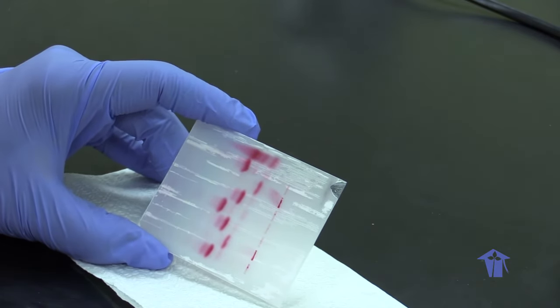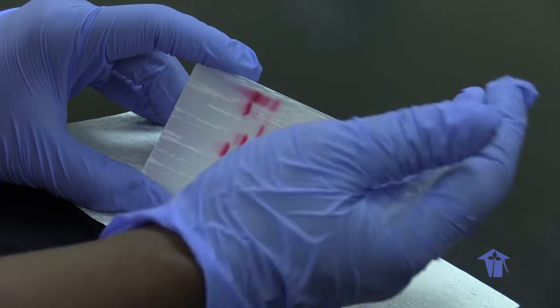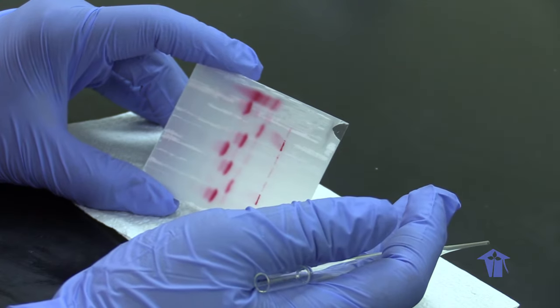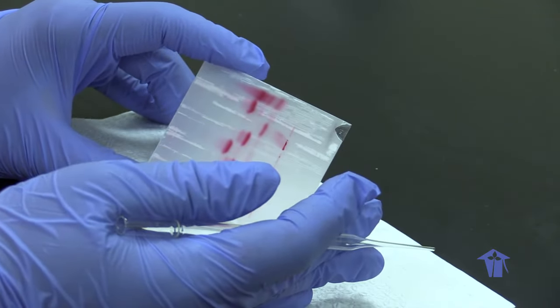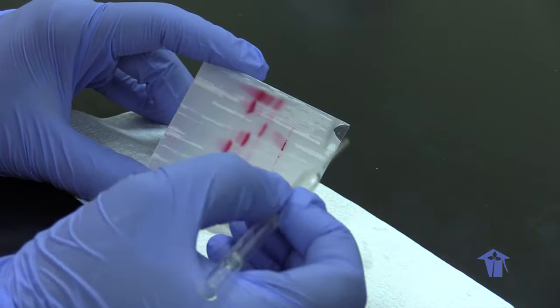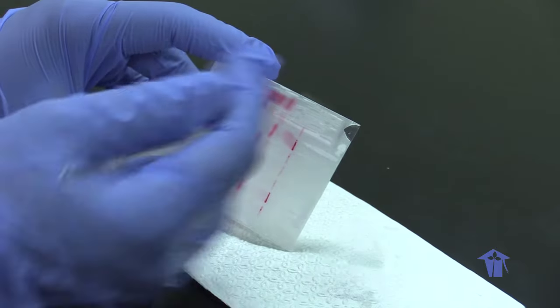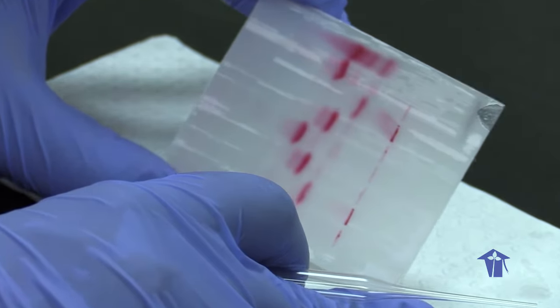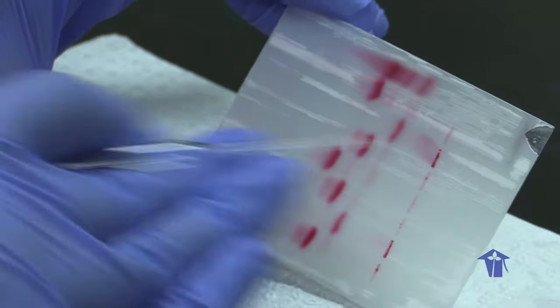Okay, so this is how the HBEP turned out. The white background that you're seeing is because of the Permaclear, so that is a limitation of the lab. Your Permaclear needs to be freshly made up, and therefore the entire plate or the acetate will be cleared up, and when it dried, the plate itself will be clear or transparent, and then you read it against a white background. But in this case, we can still see the bands.